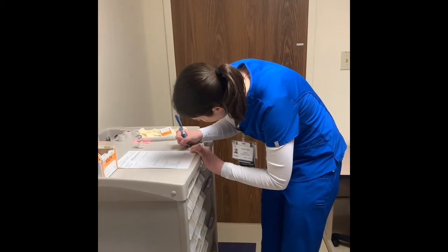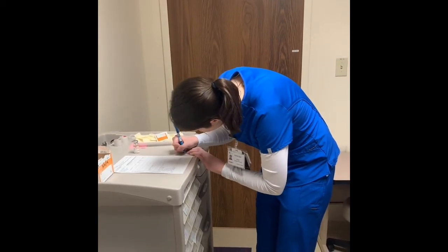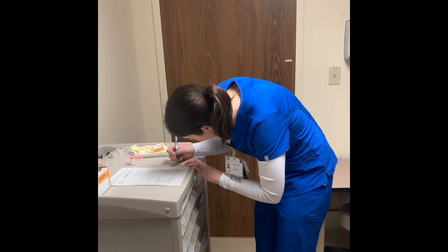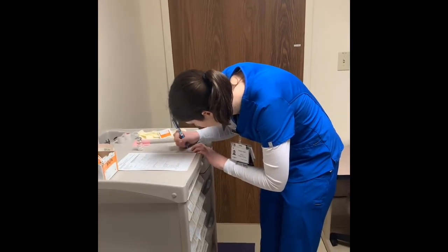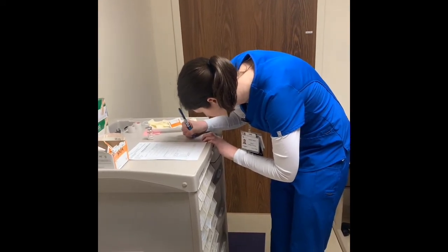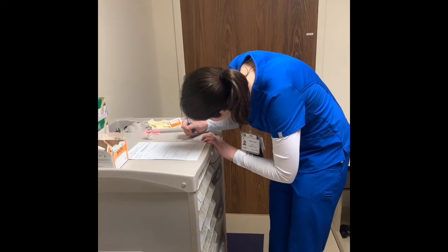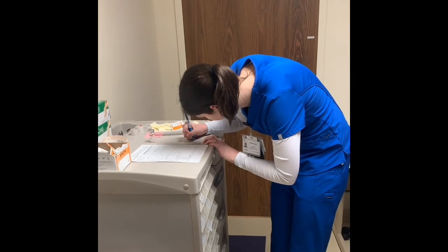Based on my calculations and the sliding scale provided here, I will be administering 20 units at this time. Today's date is February 10th, so 2/10 of 2020. It is currently 1100. And I will go ahead and initial.